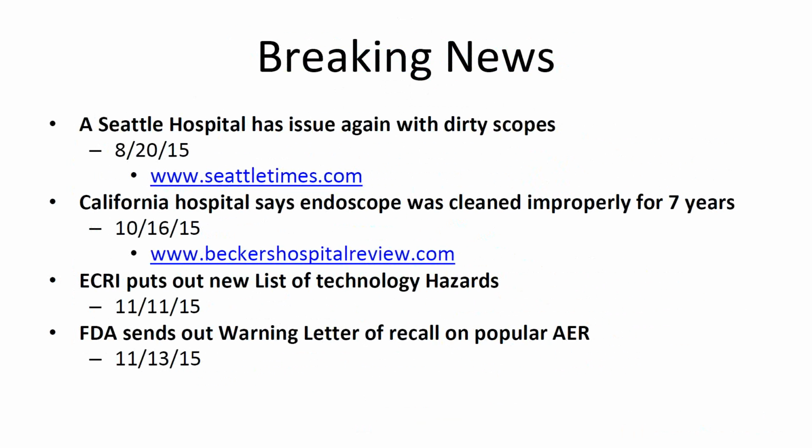So a lot's been going on, if you see this slide here. I'm going to now try to set up the importance of why ST91 has been made. In Seattle, a couple years ago, they had an issue. I'm sorry, ST91, I said 79. I'm so used to ST79, excuse me, it's ST91. In California, just recently, over 7 years, there were scopes that were improperly cleaned. ECRI, which I should address, is really like the consumer watchdog for us within the healthcare industry. And then, on Friday the 13th, the FDA put out a warning letter and a recall.